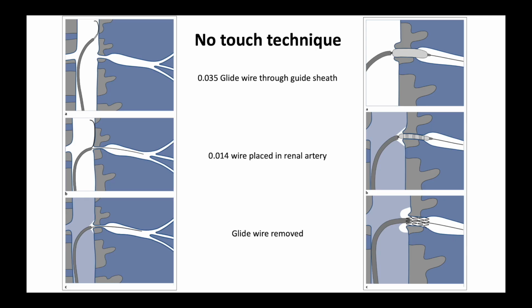So it's an aorto-ostial disease. You balloon it here, you predilate, then you take your stent in, and you keep hanging your stent a millimeter, 2 millimeter in the aorta, because what you don't want to do is miss the ostial disease, because this is aorto-ostial disease, atherosclerotic disease.